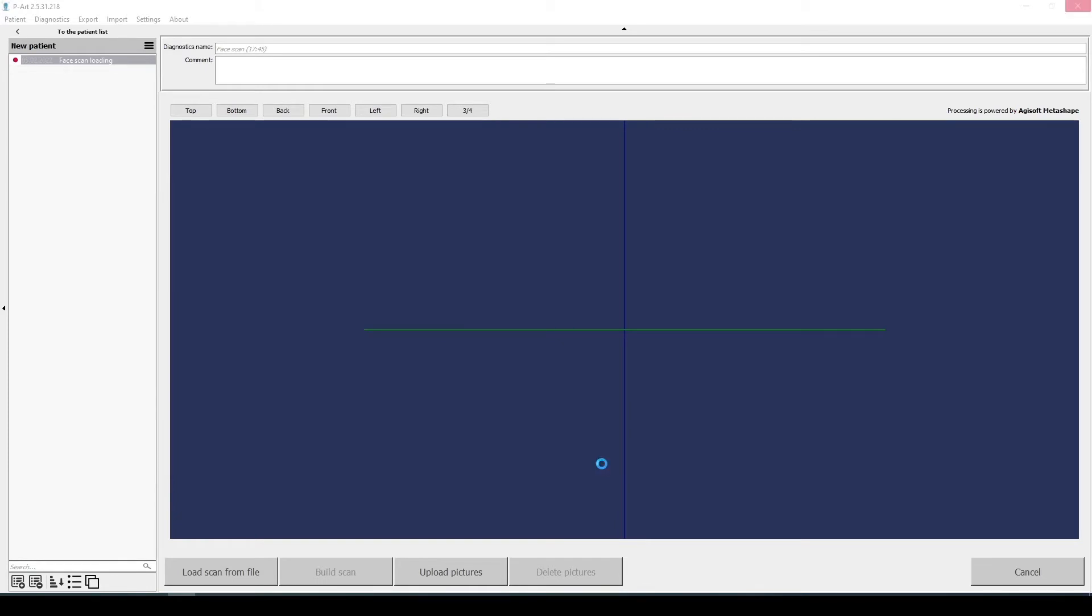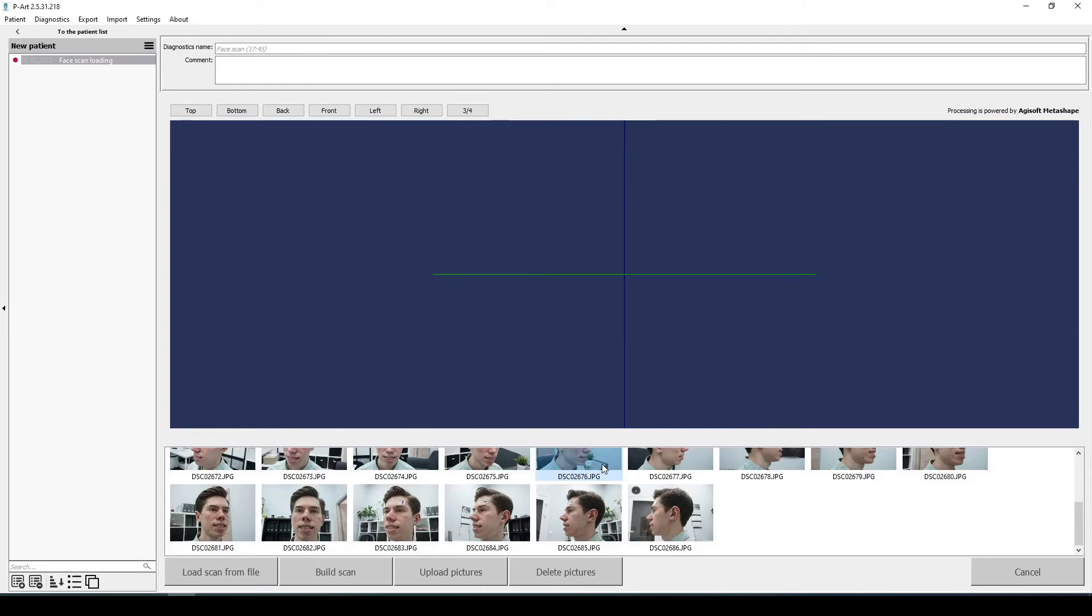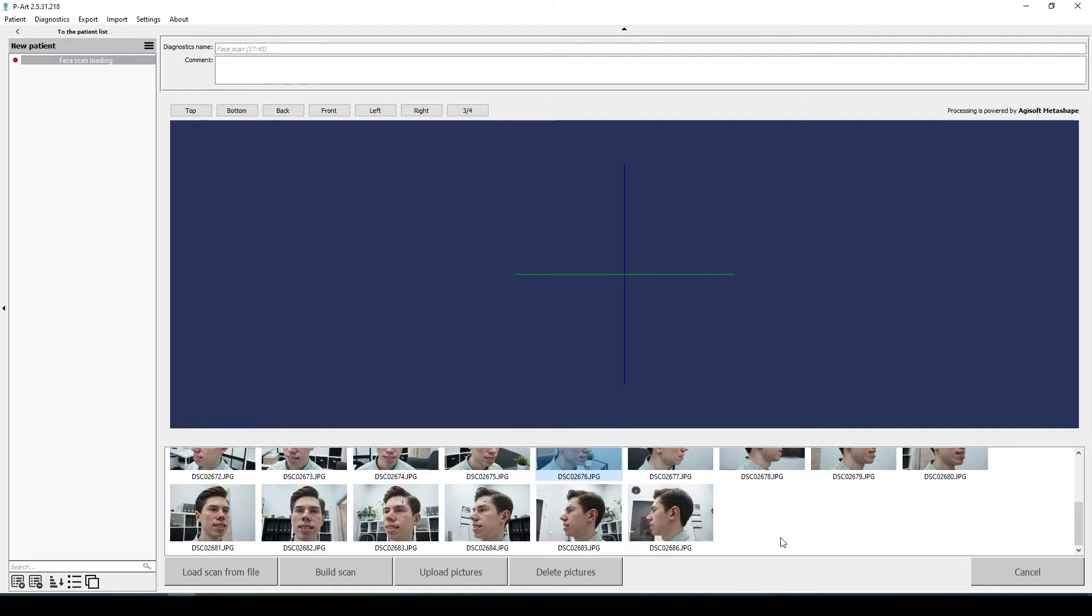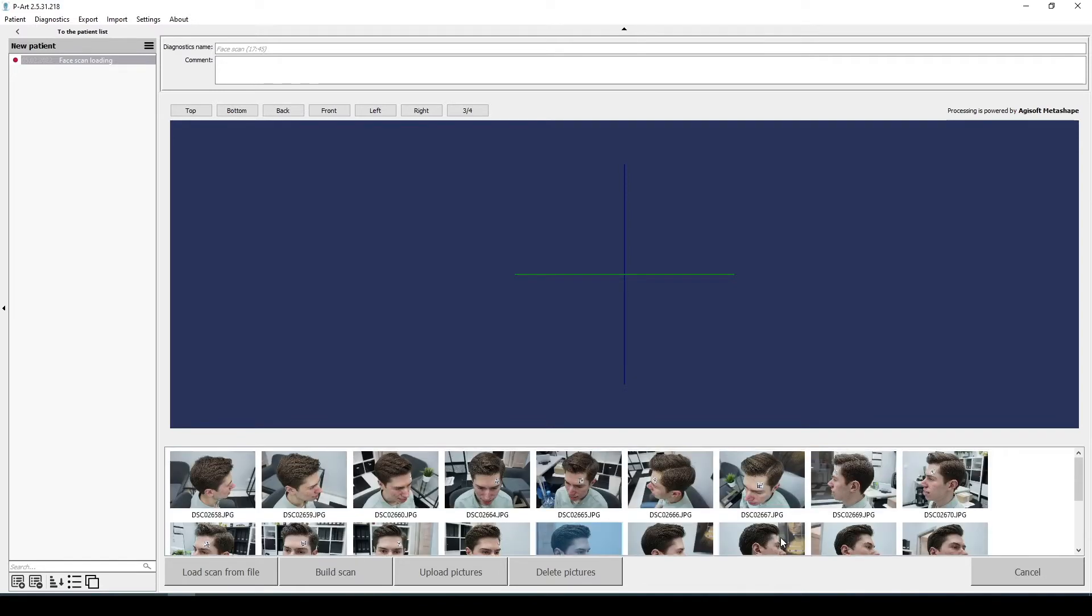While uploading photos, the program pre-analyzes the quality of the photos and other settings. If there are many photos marked with red color, it will be better to remake the photo protocol and correct quality of photos.